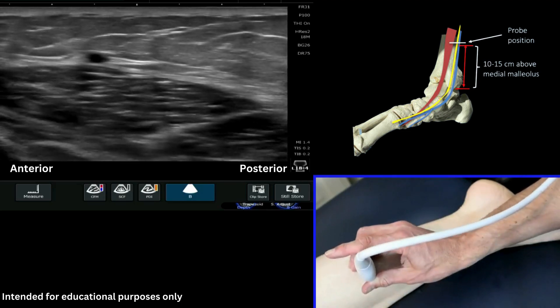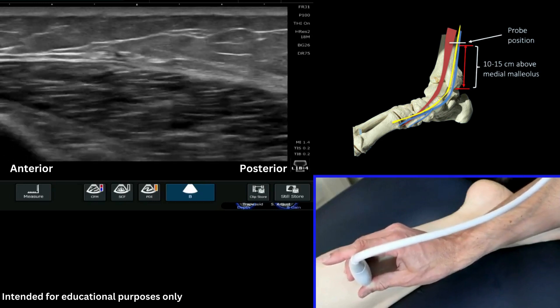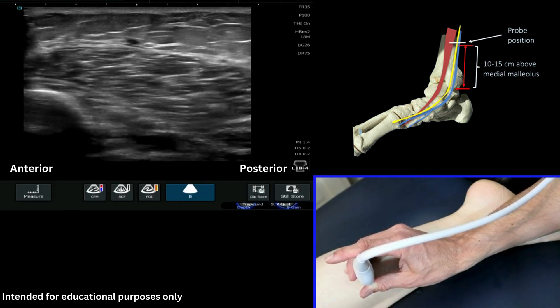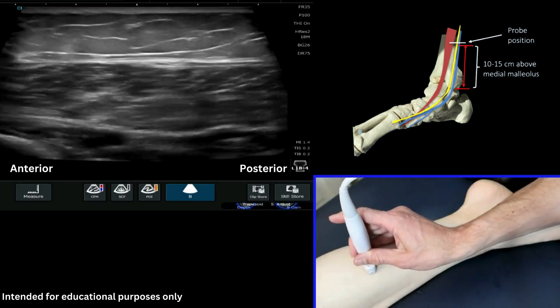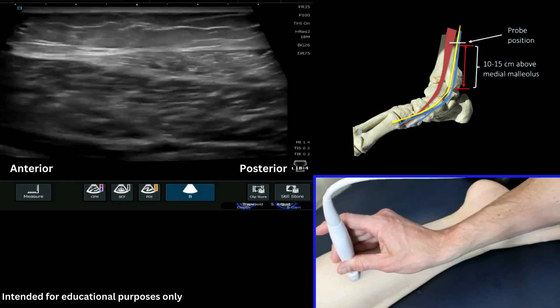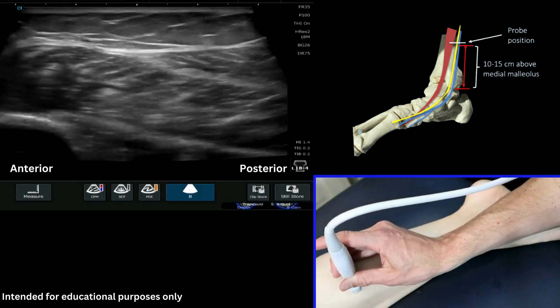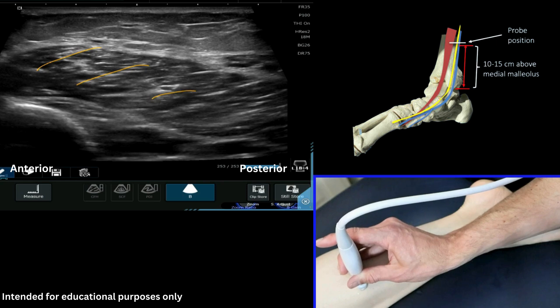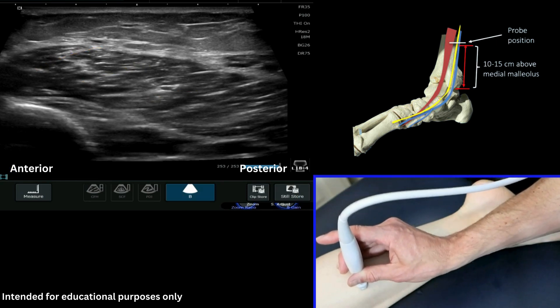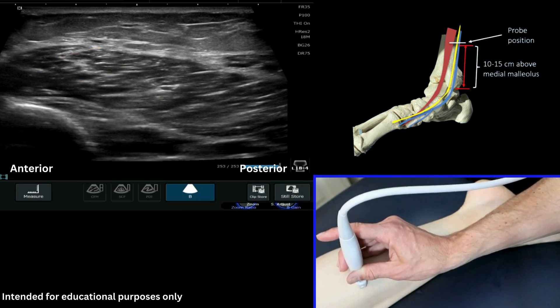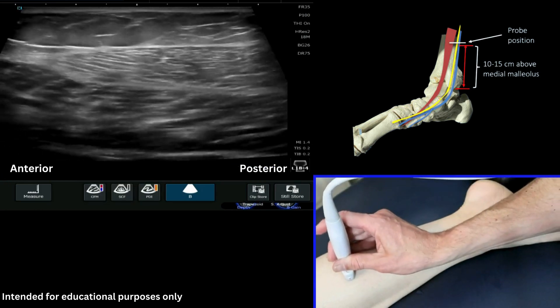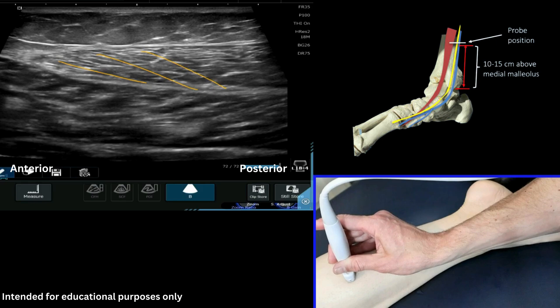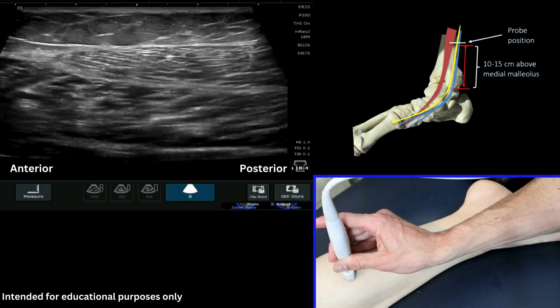If we then just track slightly more posterior — and if we just widen our view here and drop the depth a little bit — you're just sitting superficial, just to the soleus, which is here coming through the most medial aspect of the soleus essentially, and you're also going to get the first part here of the medial gastroc.